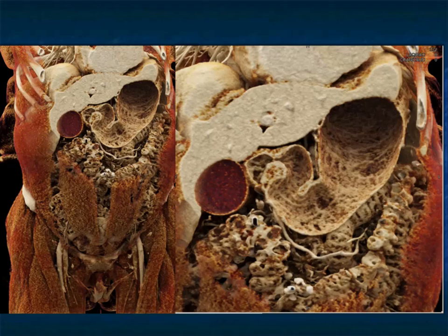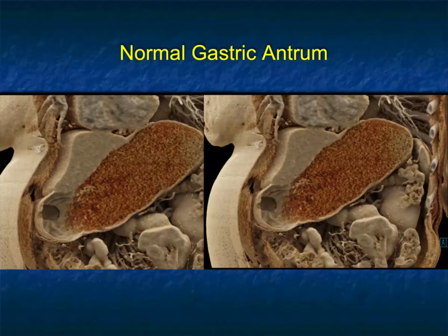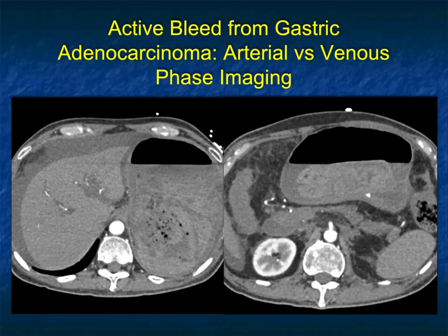The importance of technique cannot be overstated. When looking at the stomach, good distension is critical. To see a GI bleed, you need to distend the stomach. You don't want to use positive oral contrast — use water as a contrast agent. With cinematic rendering you can see beautiful detail whether looking at the fundus or down the antrum. Red represents fluid in the patient's stomach.